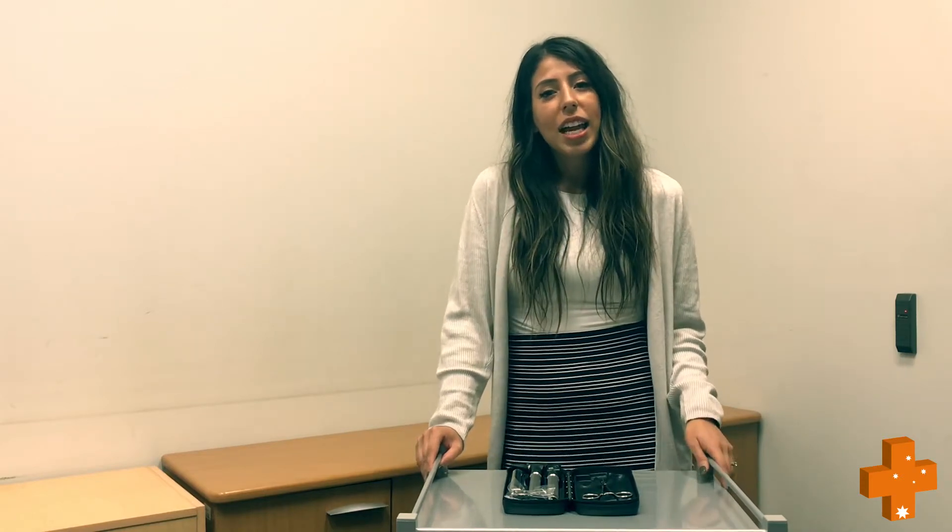Welcome to MedShop's Tricks and Tips. This video is going to show you how to change globes in an otoscope or an ophthalmoscope.